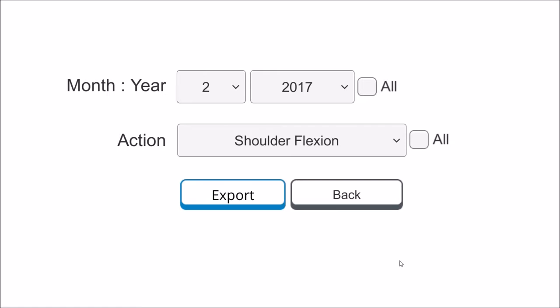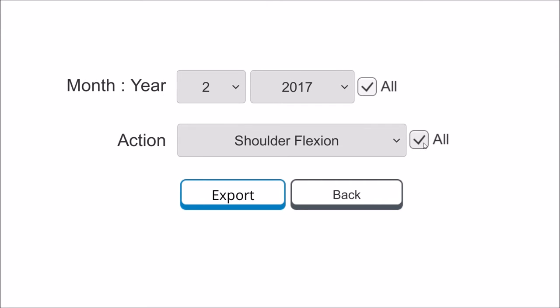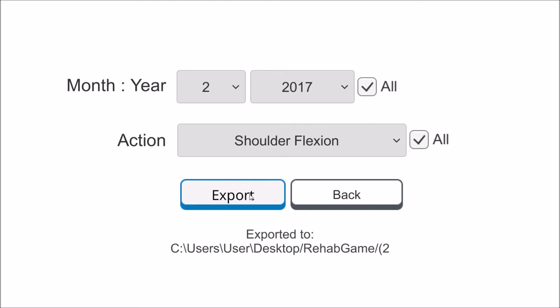Click export to export your user's progress data. This is the exporting panel. Choose the action, month, and year. Click export to export the user's progress data.